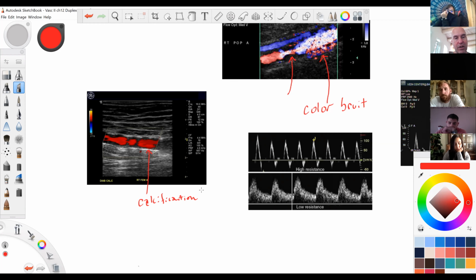Diabetic, generally the ones who have calcifications. And you could actually see shadowing coming through there. And also the loss of color and poor Doppler angle. Just notice that.